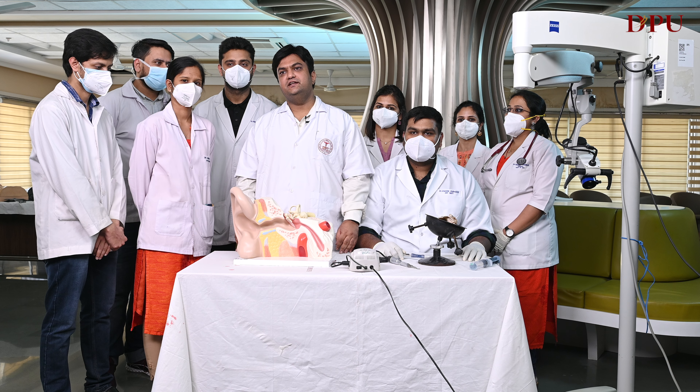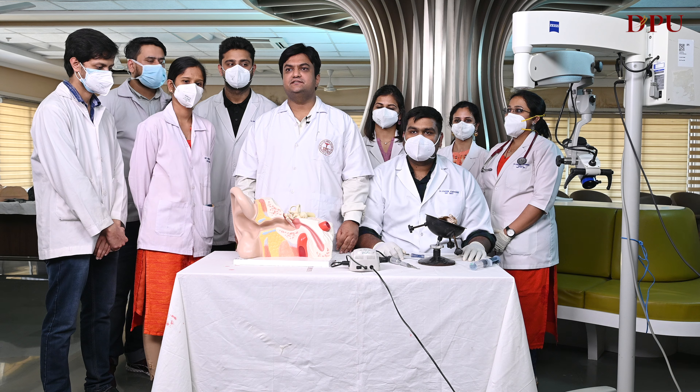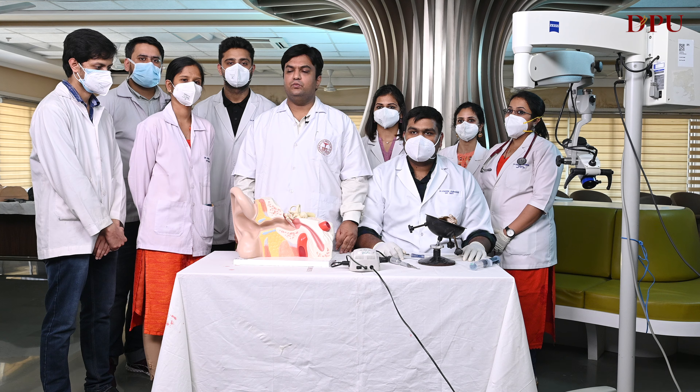Welcome to DPU's Clinical Simulation and Skills Lab. I am Dr. Parish Chavan, Associate Professor in ENT. Along with our team, I would like to demonstrate temporal bone dissection.